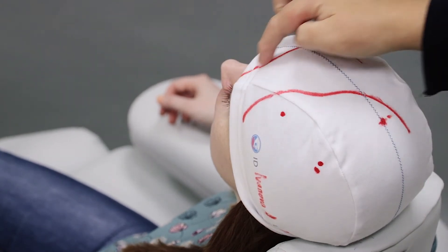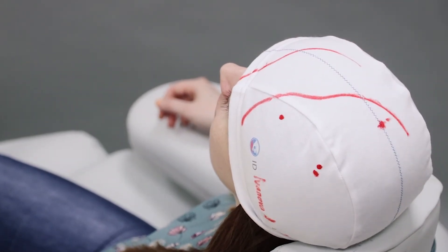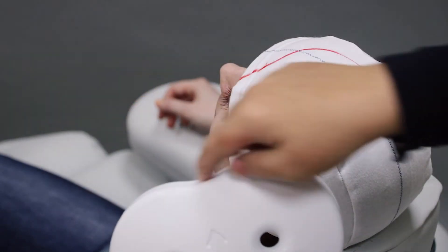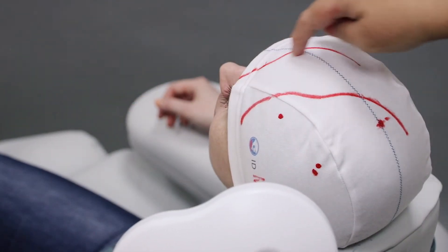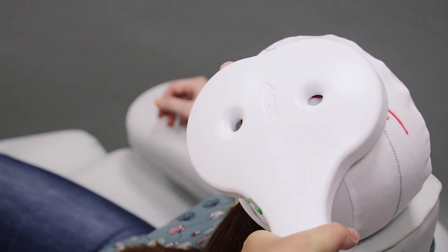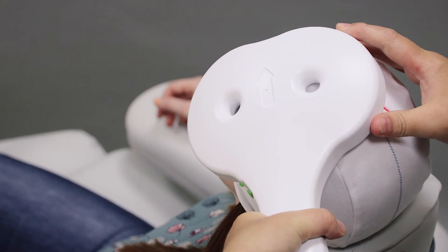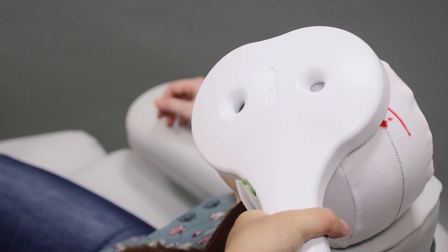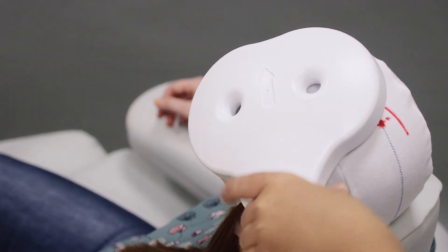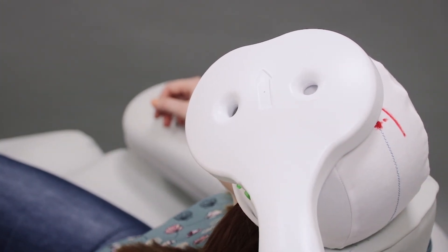This is our new line for coil positioning. I now align the front edge of the coil with the new line. The coil is now positioned on the DLPFC.